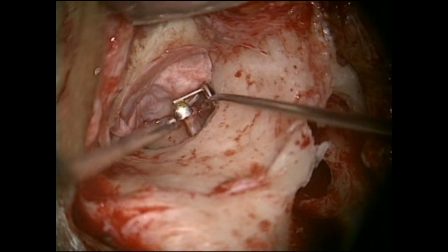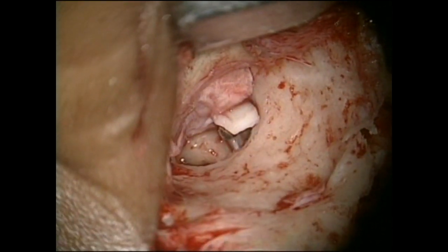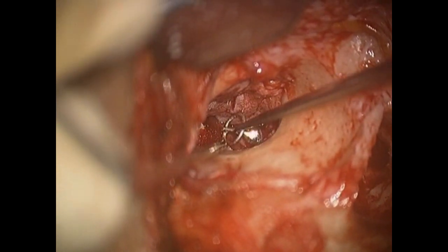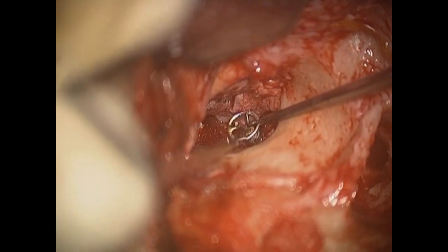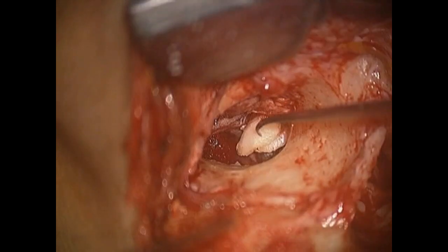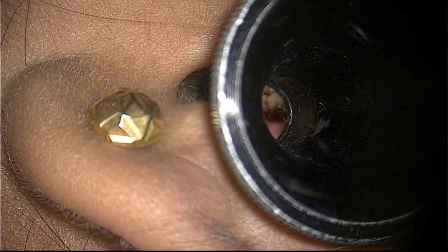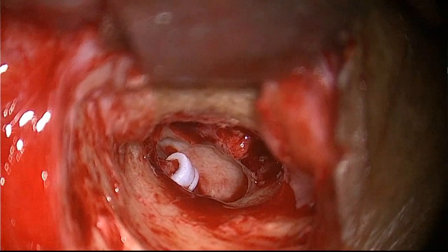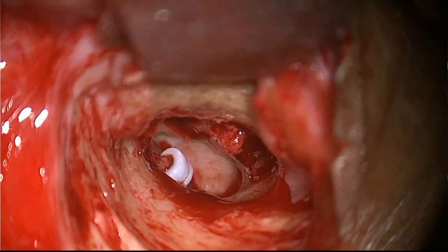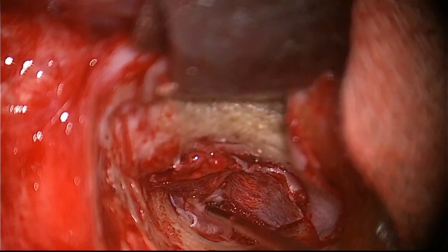This is a long process necrosis where I am using a lenticular process necrosis prosthesis. In this patient, an intact canal wall technique, I am using a titanium PORP as a short columella and a piece of cartilage is being kept on that. I have noted in many of my patients where I used synthetic materials like this, there was extrusion of the prostheses like this. I also used a grommet in between a lenticular process necrosed incus and the stapes. To look at, it was better, but post-op the patient had some problems.